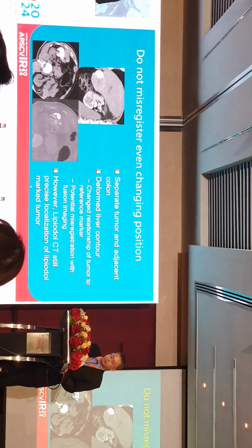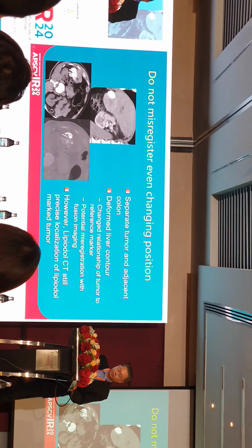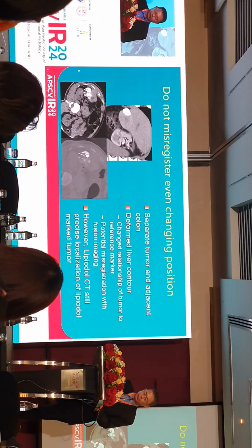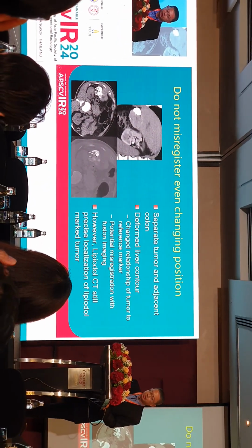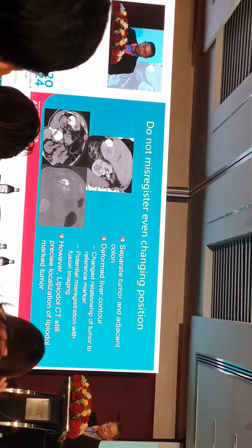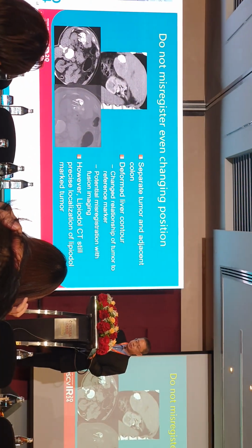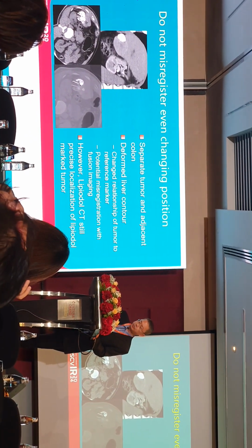And for the tumor recurrent after previous TA, we performed lipiodol TA, and there is dense lipiodol retention in the tumor. We changed the position because the tumor is in contact with the colon, and when we made the patient right side up, we could separate the tumor from the colon and insert the ablation electrode precisely into the tumor and avoid injury to the colon.